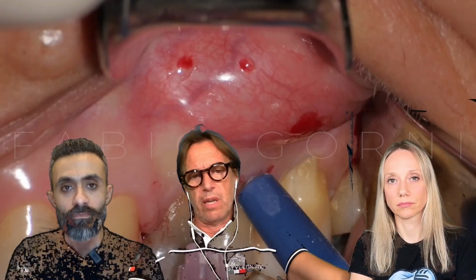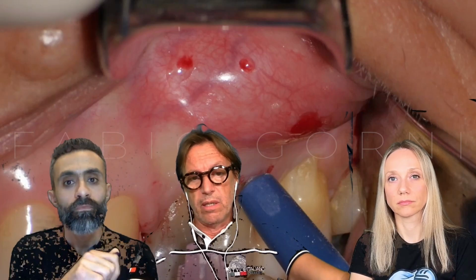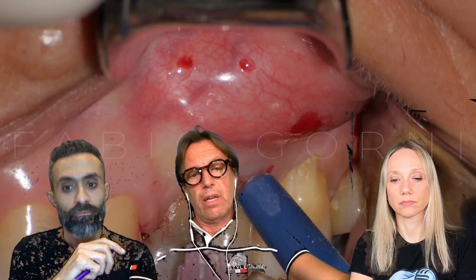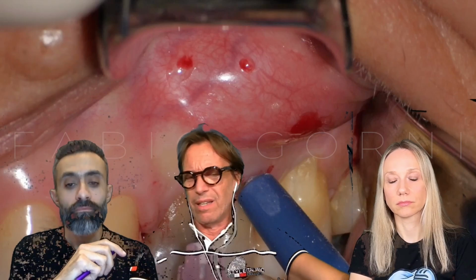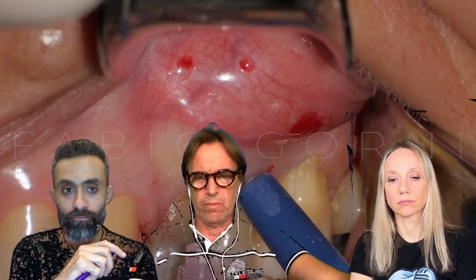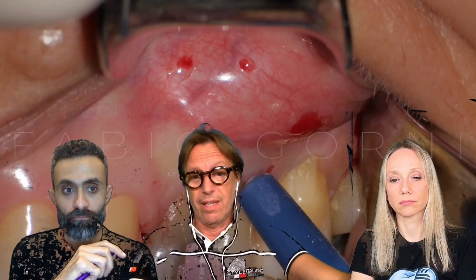After that, wait some minutes before the incision, press the fornix with gauze, and after 5 minutes we can start with the incision. In this kind of surgery, bleeding control is so important. Otherwise we cannot see anything. So that's the reason.